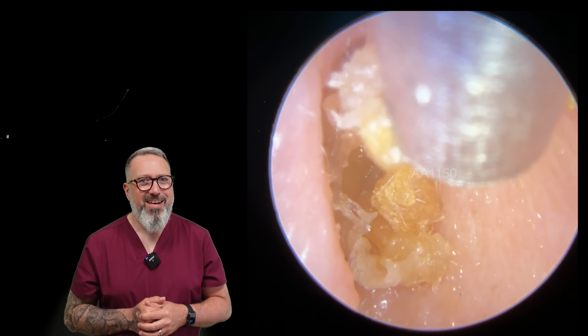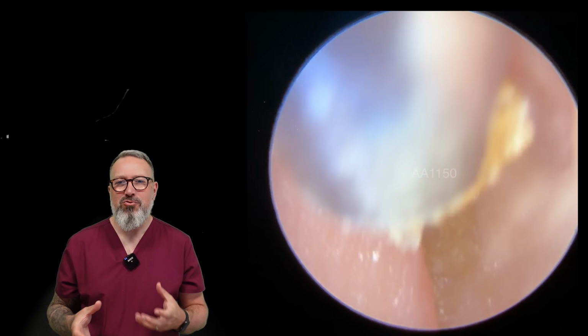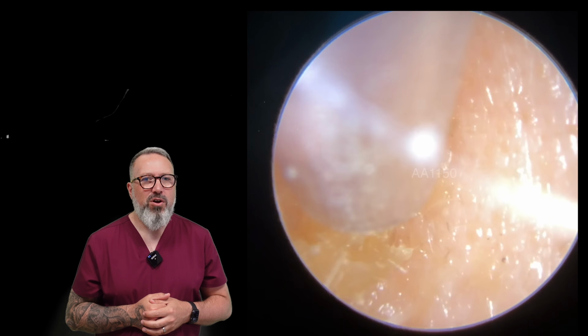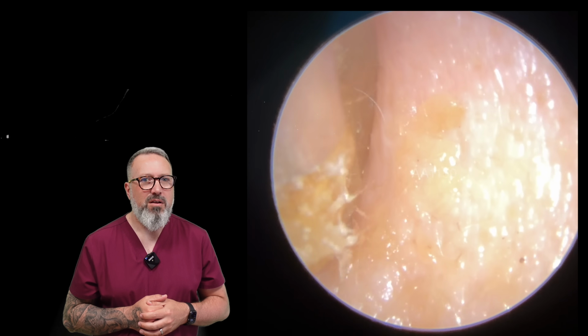It's almost there. It just needs a little bit more of a pull. You can see this side's a little bit drier, so it's got that little bit more consistency to it. It's a little bit tougher. Let's see if we can work our way around this edge now. Let's give this a little bit more of a wiggle.